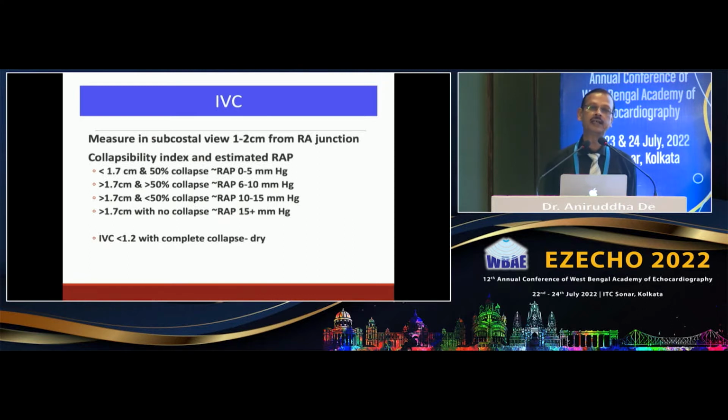Because in day-to-day practice, you have to have your IVC measurement and the collapsibility, not only in cardiology, but in every ICU, and in every emergency, because you have to find out the volume status of the patient. For the last 5 to 10 years, all the clinicians are specifically asking for the IVC status. Even if you do not give the report, they force you to give it. So it is very important to give the IVC.